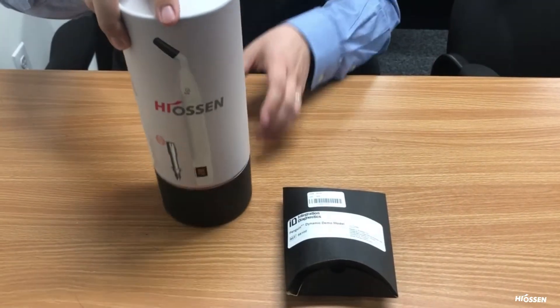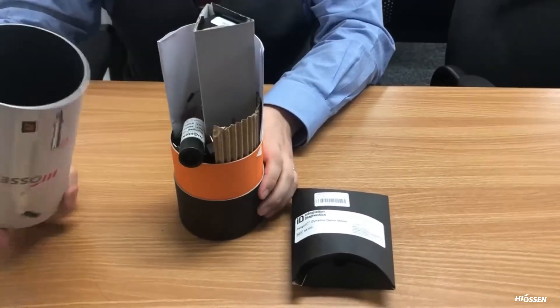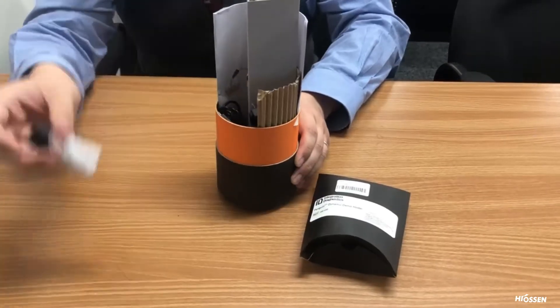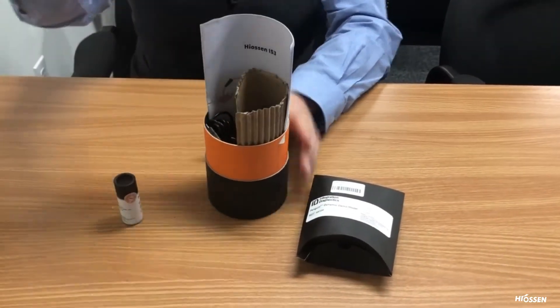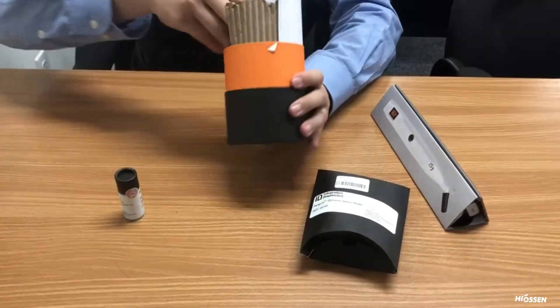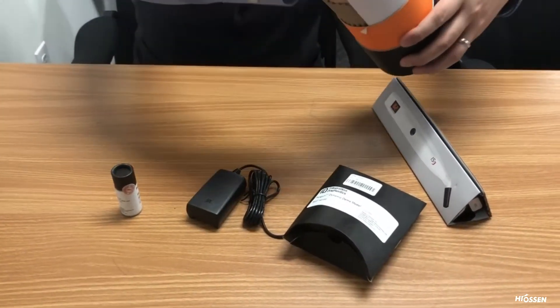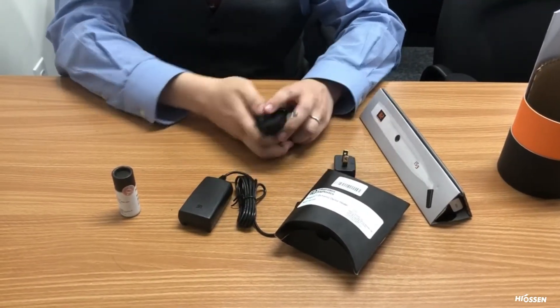We're going to briefly go over a demonstration with your doctor. If you lift up the casing, you'll see an assortment of different parts and pieces — the unit, power cord, and wall adapters for different parts of the world.